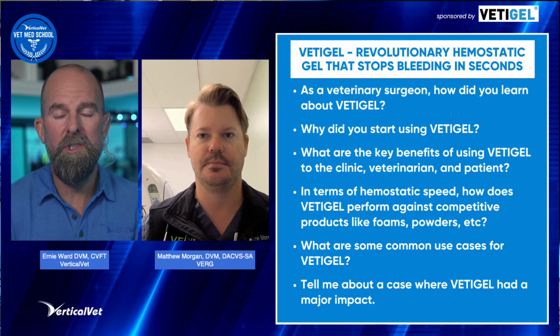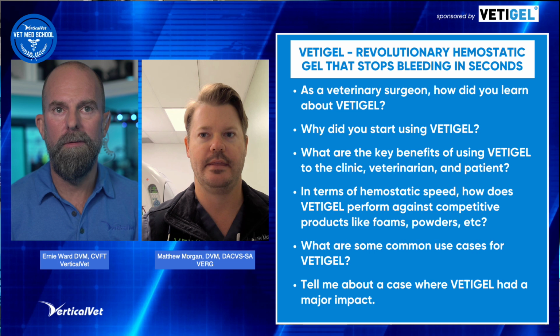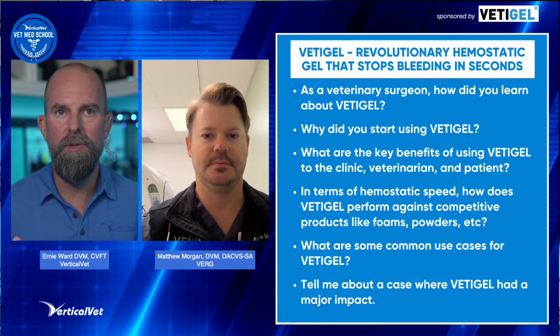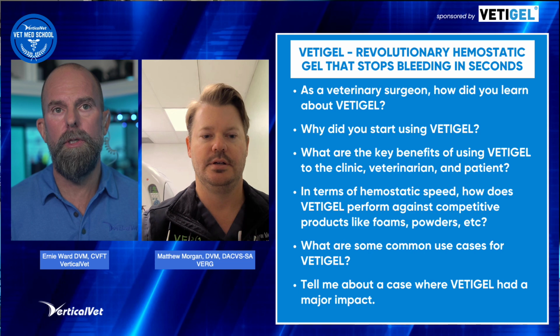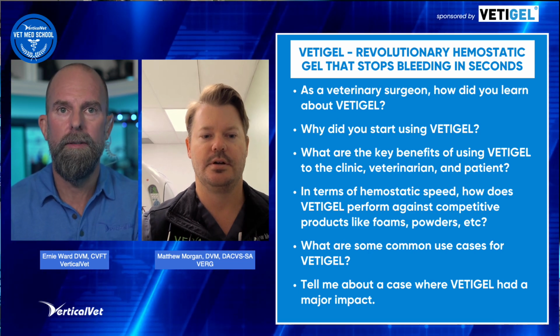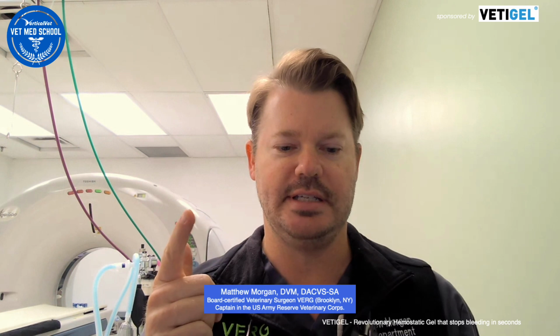Wow, that is amazing. And that leads us to another good question, and that is, where do you see us using it? I know you've rolled off several applications and potential uses, but give us some use cases that you think a general practitioner is most likely to encounter. Well, I'd say things like enucleations and dental procedures are by far going to be some of the more common things that you're seeing and needing bleeding control for. So I think that's going to be a great application for it.